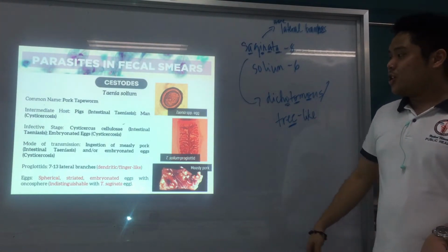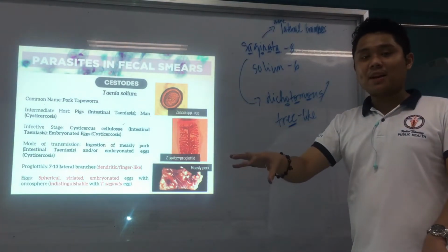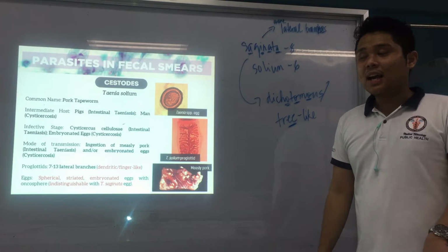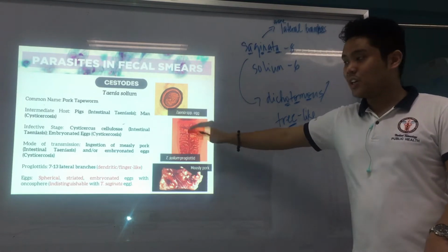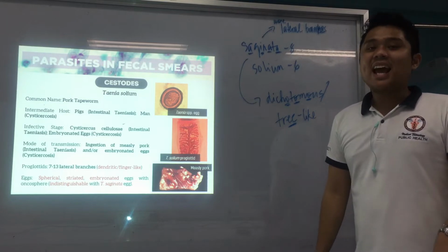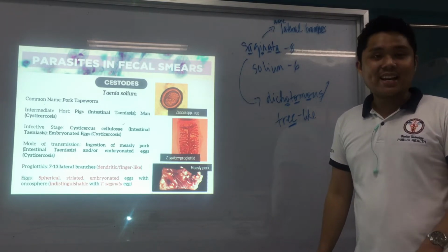Okay? Alright. And don't forget what stain can be used to inject the proglottid of your Taenia species to help in the identification, because we use proglottids to identify the species. What stain is that? India ink.